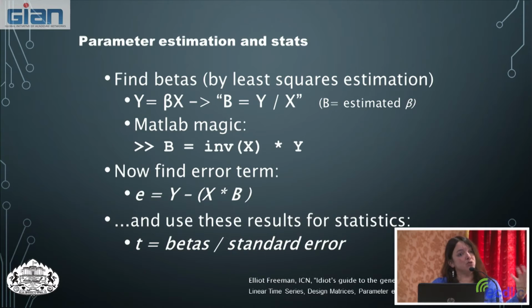Because if you imagine trying to do this for, say, 64 by 64 voxels in one slice, and then we have maybe 30 slices, we end up with thousands of voxels. So in order to do a least squares fit of each of these, that's a big computation. So we're going to estimate these model parameters.